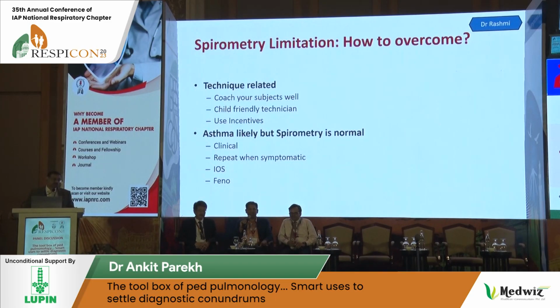Though you are correct that it will not be affected, the reproducibility is poor, and even in adults, studies have shown that it is unreliable. Unless the exhalation time is adequate, it will not work, even if an effort is there.